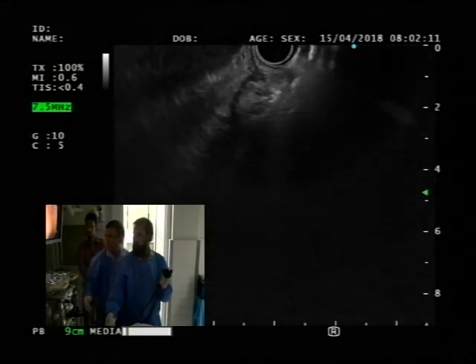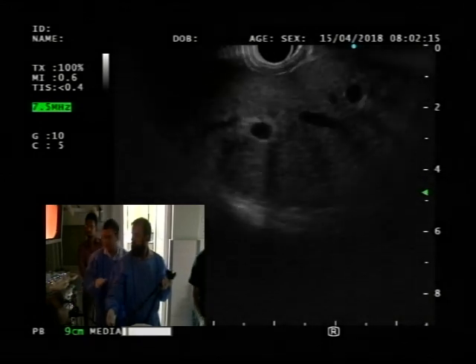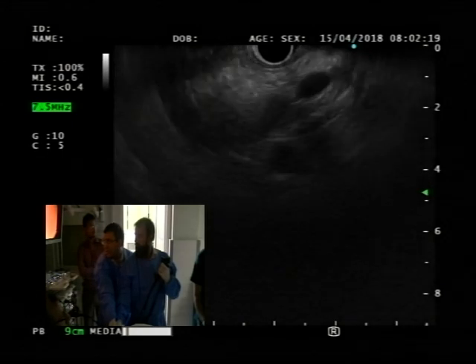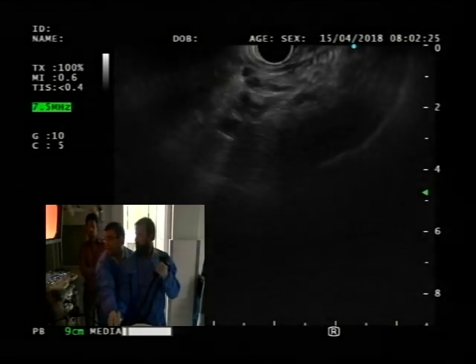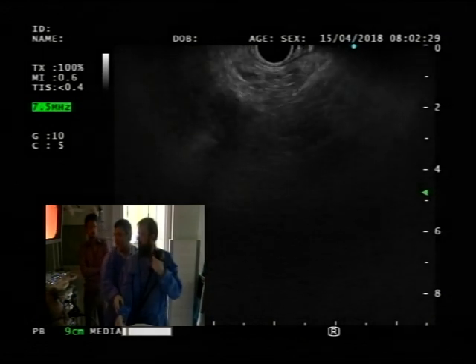Okay, here, now big wheel towards you again. Okay, let's try again. So just rotating to the right, okay, stay there. We are seeing the pancreas already, so let's get to the aorta. Right there, okay. Take it, yeah, bring it there.